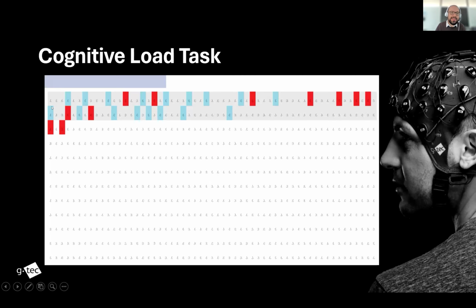So on the scope, as you can see on the left side, we'll be able to see in real time if they are being engaged during the d2 task or in the resting state with low engagement. You can see, for example, on the pre-recorded data from an experiment that we did in the past, that the values are positive, from 0 microvolts to 10 microvolts. This means engagement, as you can see on the graphic on the left. And in the resting state task, you will see that engagement will be low, with negative numbers, 0 to minus 10 microvolts.